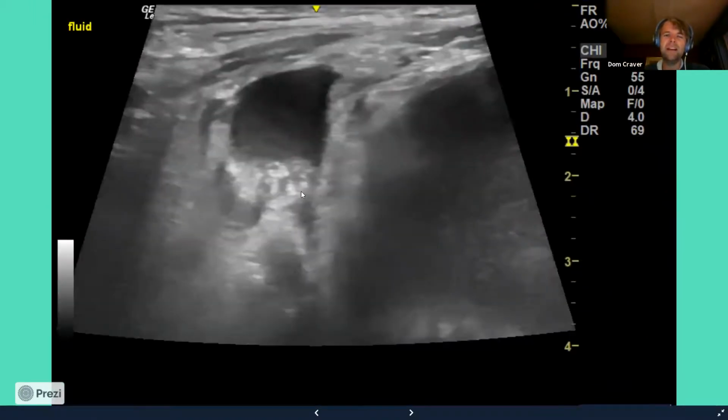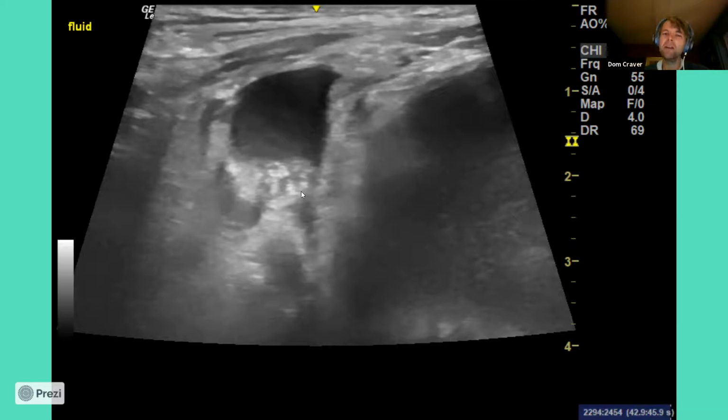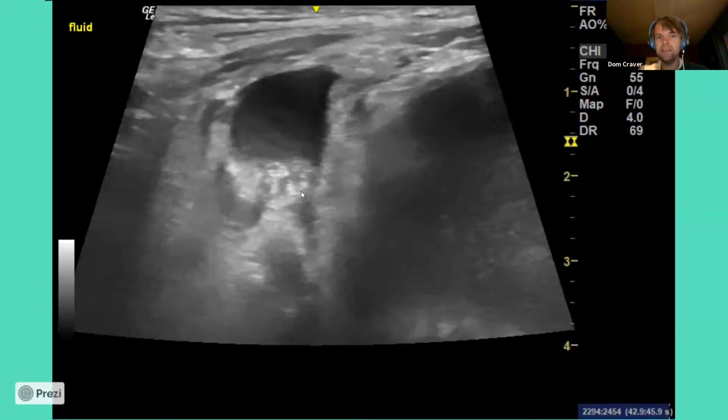And he'd been given some morphine. He wanted some mummy. He was really hungry. He wanted something to drink. So I stopped it there because, you know, it's point of care. We don't need to find the exact image in this kind of case. But what we did, I called the paediatric radiologist to say, can you find this? Can you find it for us?